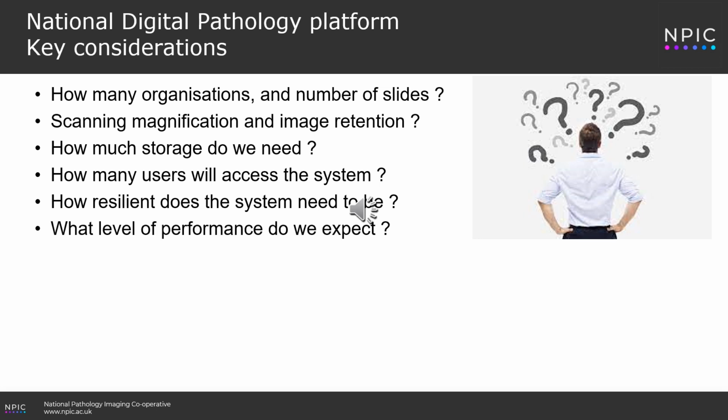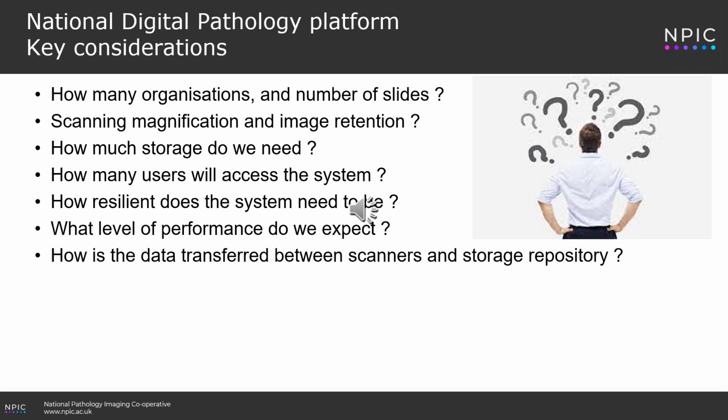What level of performance do we expect? This is normally the pathologist experience when viewing the digital image, but it also links to workflow expectations. The data transfer between scanners and the storage repository is very important. We didn't want to be responsible for bringing our whole trust network down just because we ended up loading a few too many glass slides into the scanner at the same time.